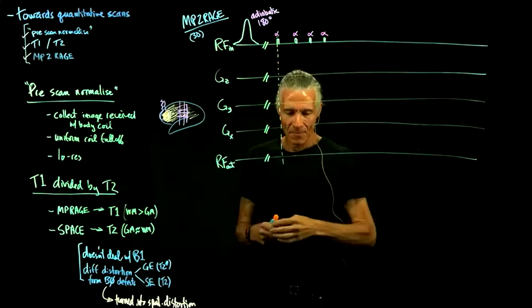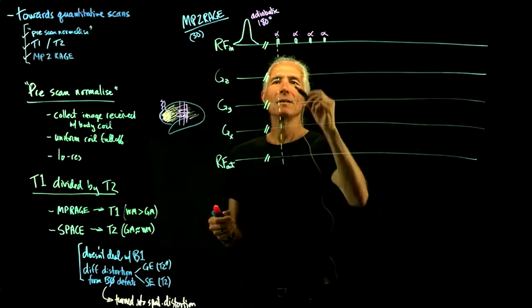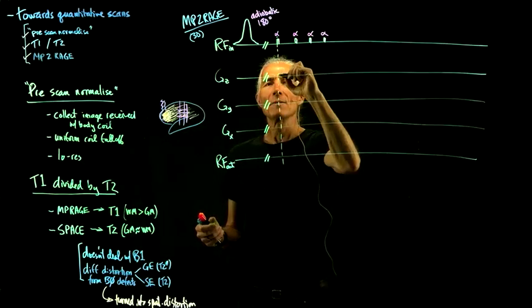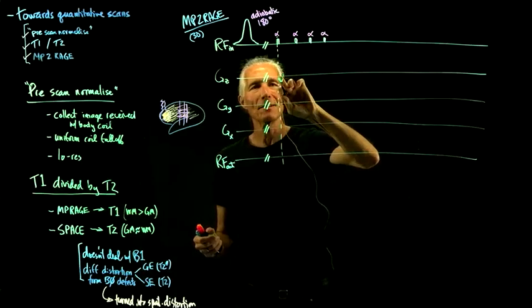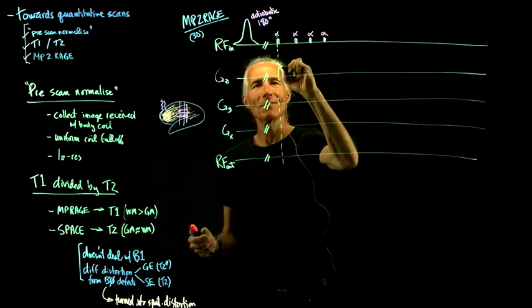And then we're trying to read out the data as absolutely quickly as possible. And so we have to do some phase encoding on the partition direction. So that was, remember, the second phase encode, because it's a 3D scan.